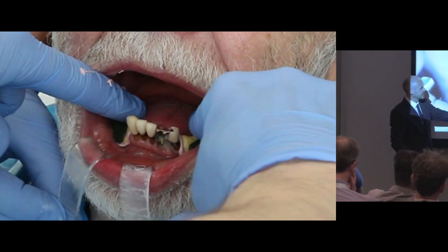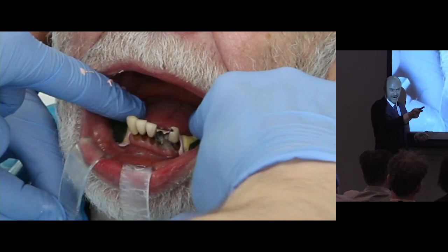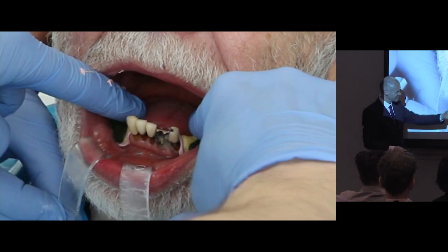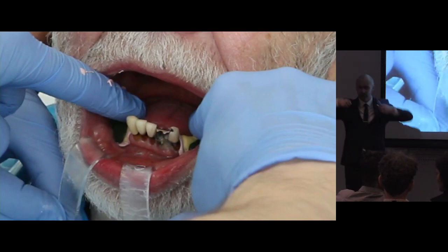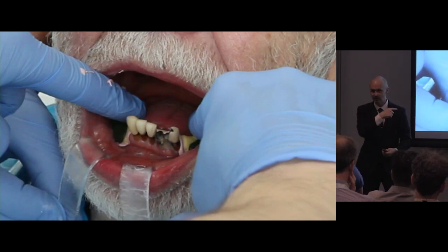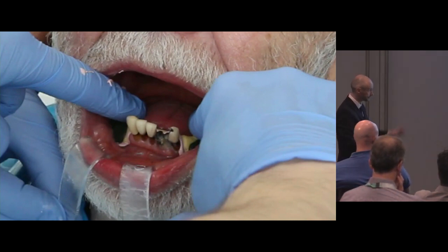Claire uses these little retractors. Do you use those since you've been to Japan? They're flipping ace, they really are. Seriously, it's wonderful. All we have done is take photographic retractors and just ground them down, so they're just little hooks. And I can see what I'm doing then. And then Claire just pulls that away.